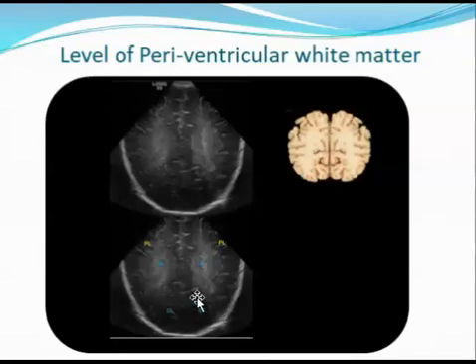You will see over here the occipital cortex, and you will also see the parietal lobes, and the periventricular white matter or periventricular blush more prominently in this view. This echogenic area represents the vascular markings as well as the neurons extending from the deep white matter to the cortex. So look for any abnormality, any asymmetry or any cystic changes in this white matter.